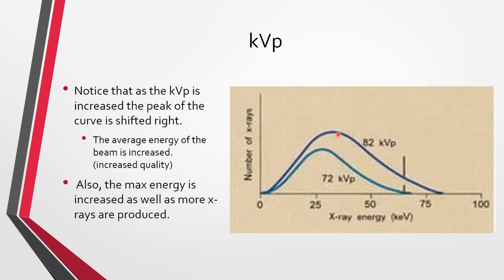Also, the max energy is increased as more X-rays are produced. So the max energy is increased as well as more X-rays being produced. The interesting thing to do here is to see what the difference between these two is.